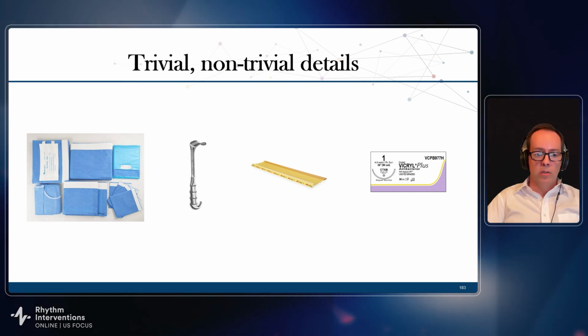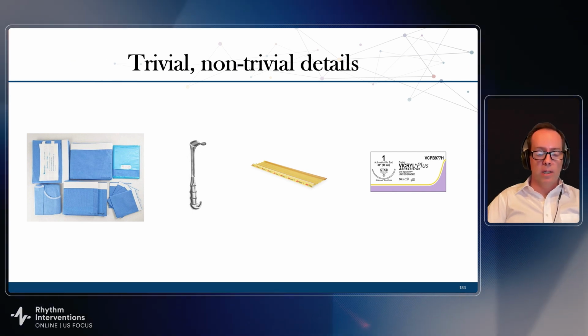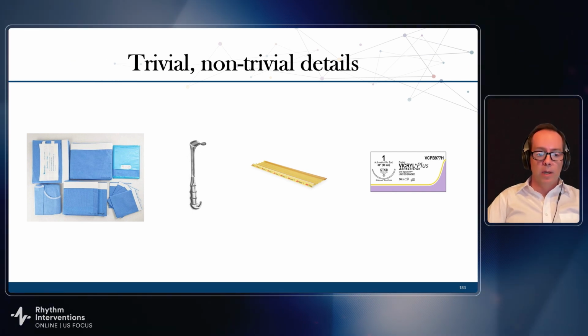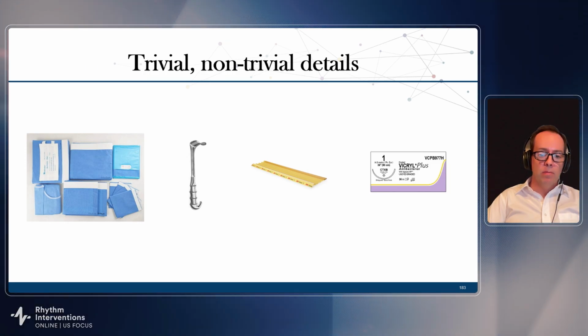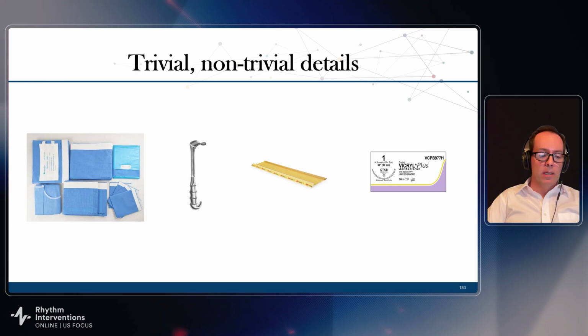Okay. So this video is really going to focus on the implant. But before even the implant starts, let's talk about some important tools that I've learned really work.